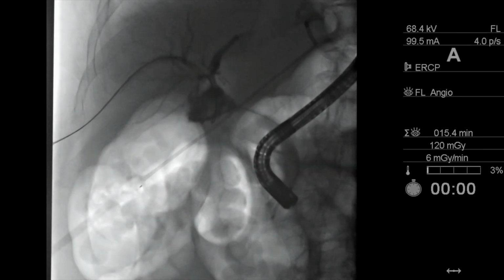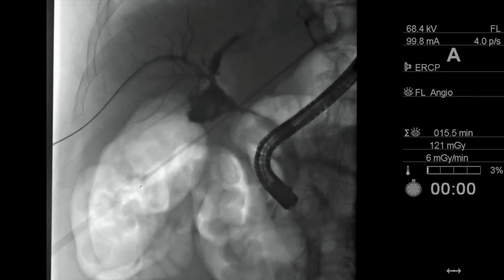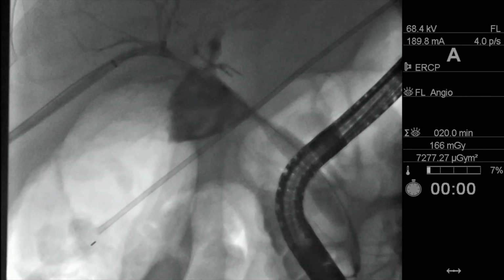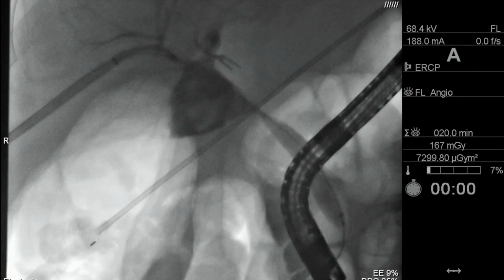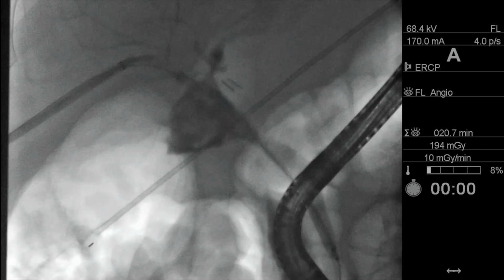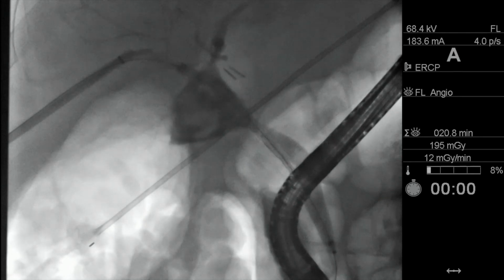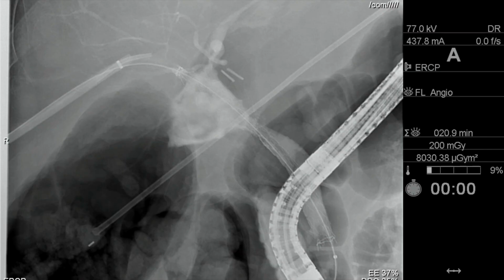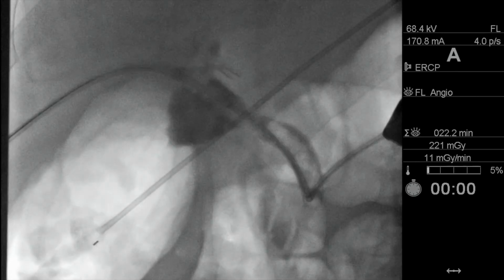An occlusion cholangiogram performed near the area of the presumed bifurcation demonstrated filling of both the right and left hepatic ducts. A 10 mm by 10 cm non-foreshortening, fully covered self-expandable biliary stent was placed into the bile duct to traverse the site of transection. The stent was placed such that the proximal aspect of the stent was in the right main hepatic duct, and the distal aspect was left completely intraductal in the distal common bile duct. Contrast from both the right and left hepatic ducts drained rapidly.